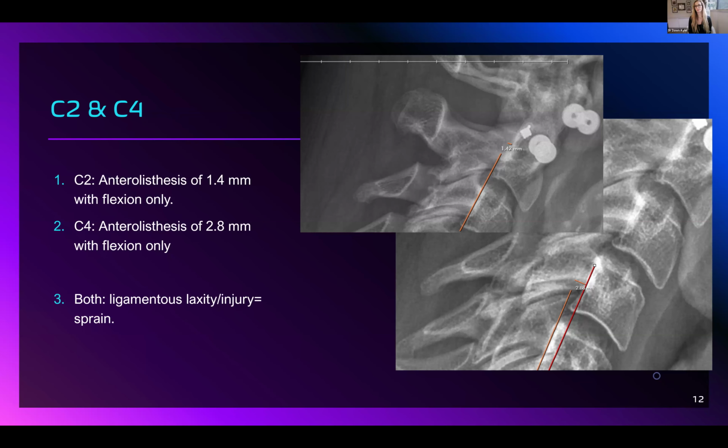So they are in the category of ligamentous laxity because there has been overstretching of these ligaments. They may have some pain in those regions, maybe not. But again, it goes back to what are the clinical findings and if they can be ratable, maybe at a lower grade, not of the category 4 that we saw at C3, but maybe at category 1 and 2. It's better than nothing, but it shows that there is ligament injury for this patient.